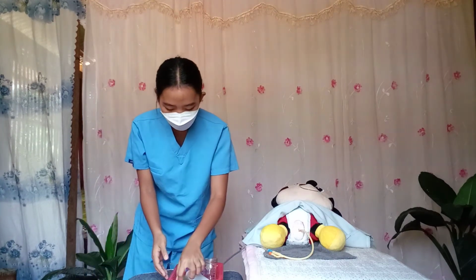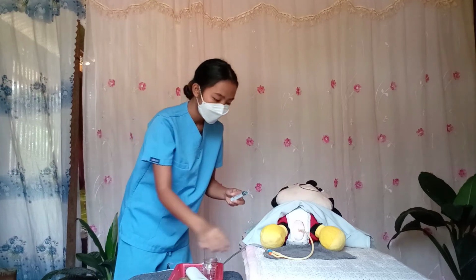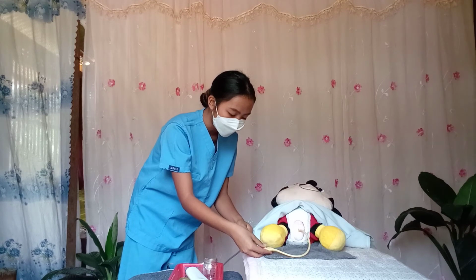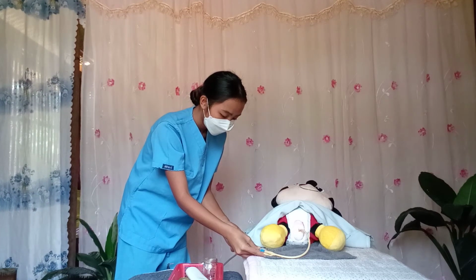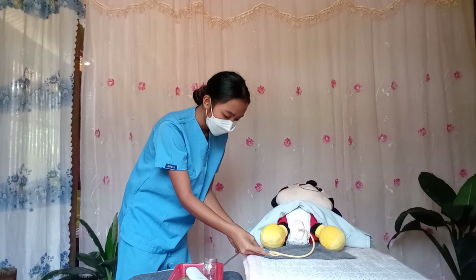This is another portion of my tray. So the first thing that we're going to do is to deflate the balloon. Easily.